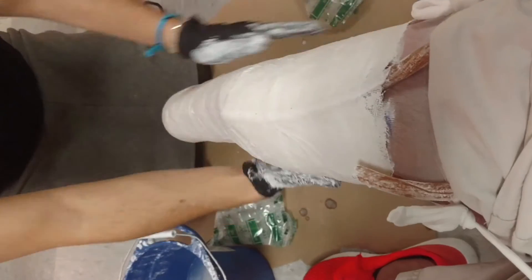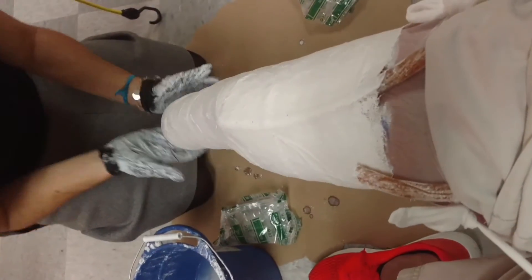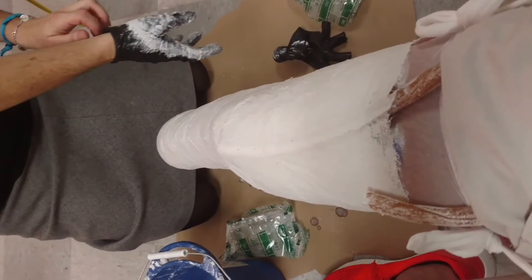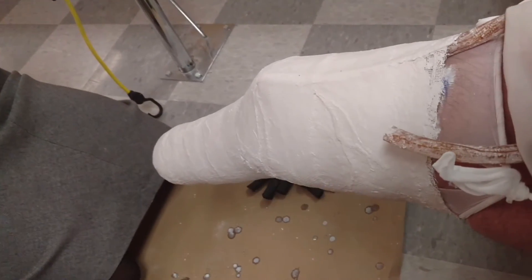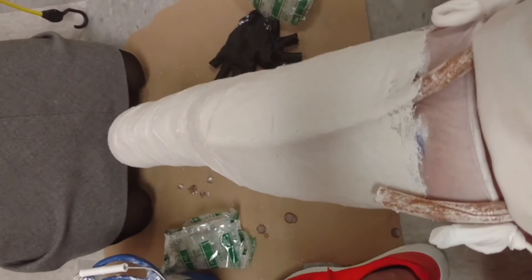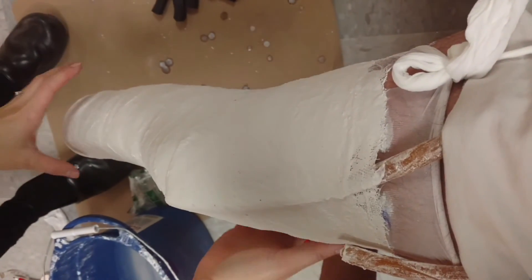It's not because it didn't fit, it's just that it was thrown out of it so soon. So when you're shrinking that fast, I think it'll shrink pretty fast. I didn't have the measurements to compare it to. You're wearing pads and you're wearing 10 ply, but before the pads you would probably be wearing 25 ply of socks. So that's it — casting process.